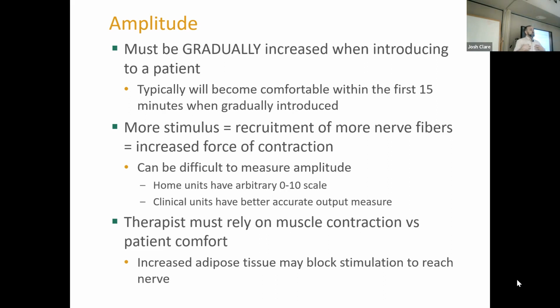Once we as the clinicians see that all of the muscle fibers are firing, we don't need to keep ratcheting it up. That's the goal. All the muscle fibers firing. And I think if we were to use maybe our TENS units, we would see, oh, it's initially just a couple of fibers, but then as we ratchet up, it's a couple more. Do you guys remember that with your TENS units? So that's basically what this is going to be like.